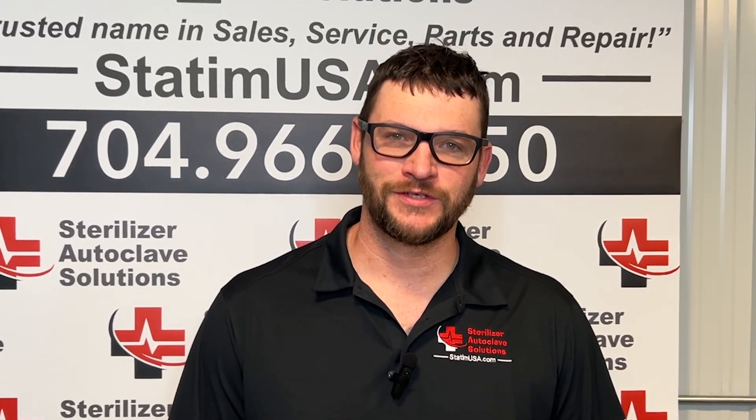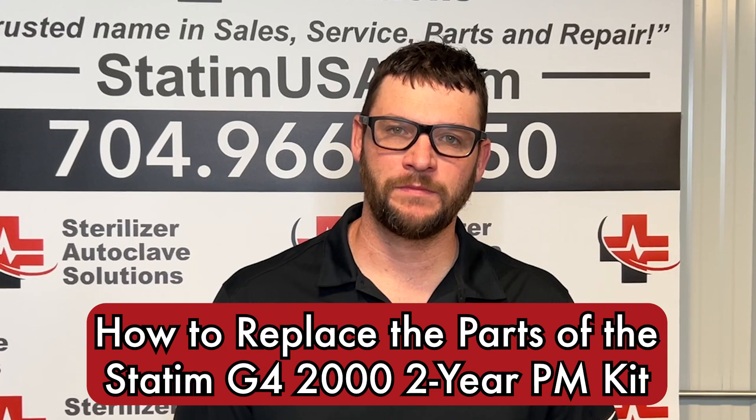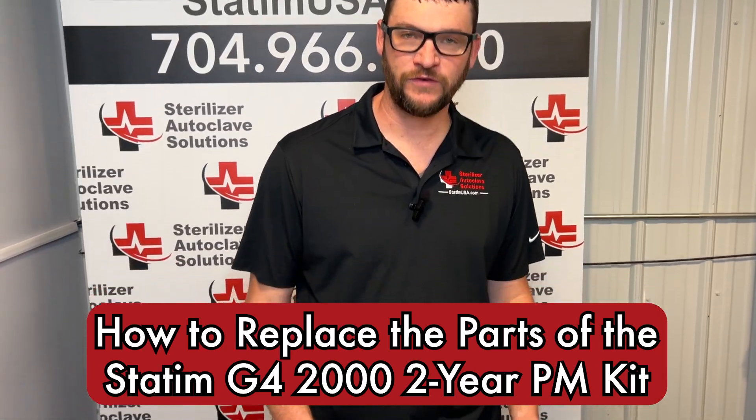Hi, this is Ian with Sterilizer Autoclave Solutions. Today we are going to be doing the two-year PM kit on a STATUM G4-2000.